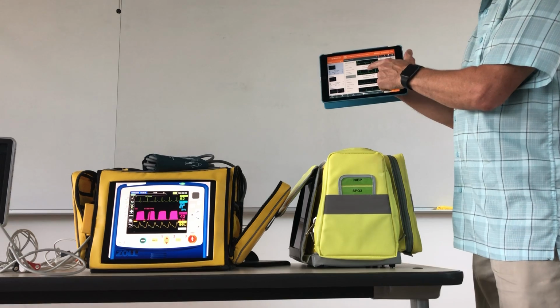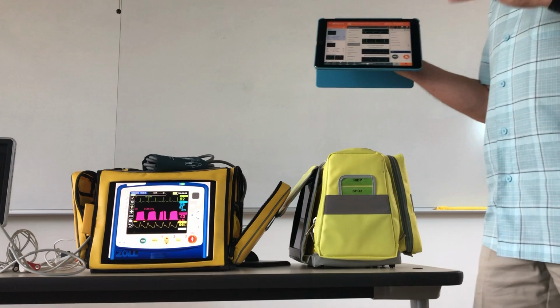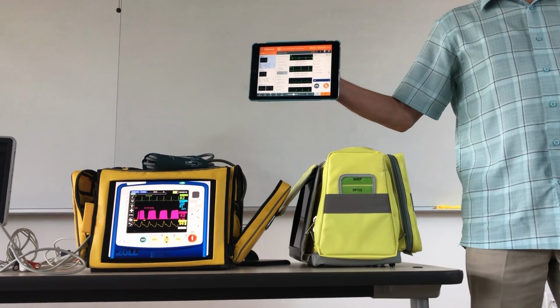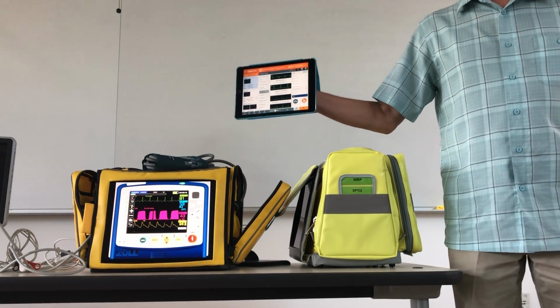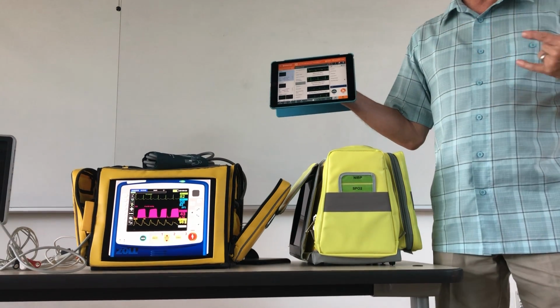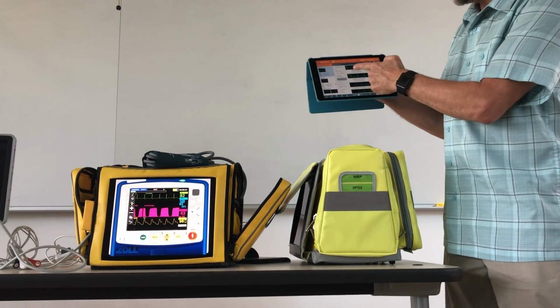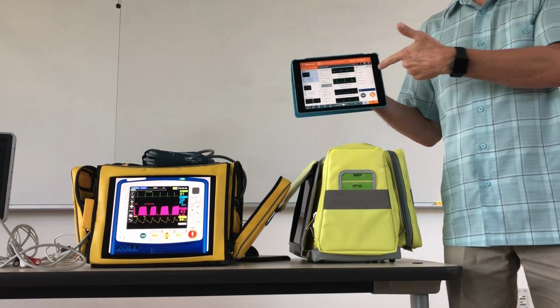What you'll notice on the ECG, and this is a new addition as of about 6 months ago, is that in the earlier edition, the 12 lead was a thing over here. If you wanted to do a scenario with a 12 lead, you picked from one of a dozen 12 leads. And then you had rhythms, and you would try to match a rhythm that kind of looked like the 12 choices they had. They have now integrated, so I think they're up to 40 or 50 of them where they're connected. And that's like software magic that they're actually doing. But that means that any of them that have a little 12 symbol in it has a 12 lead available that's linked to that rhythm.